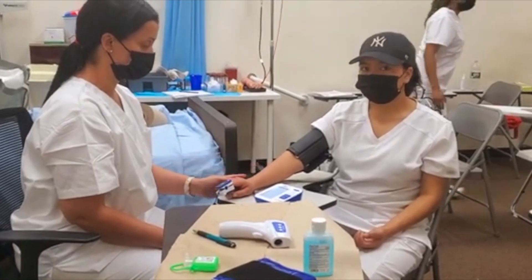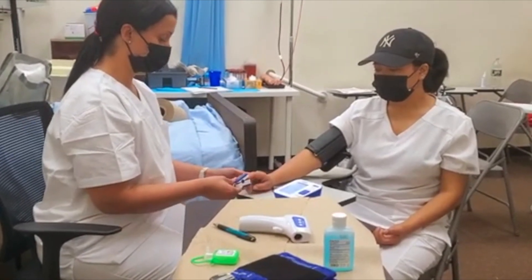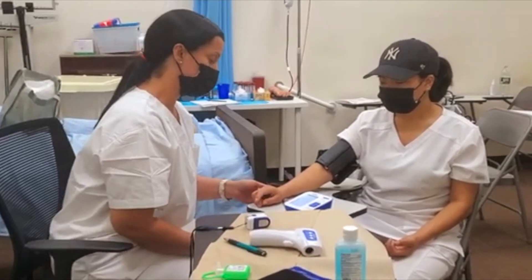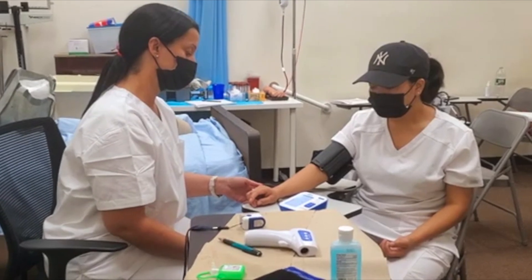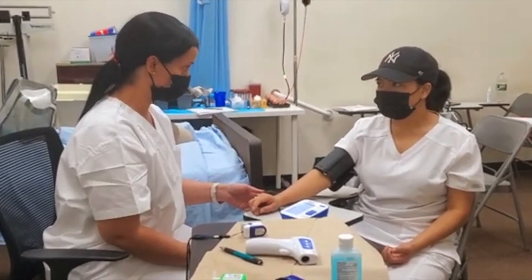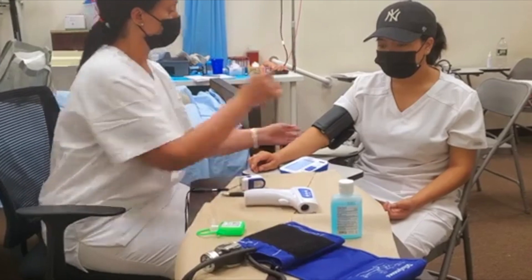We create these videos to help students and to increase their clinical skills. So your pulse oximeter oxygen reading is 89, and your blood pressure — the systolic is 105 over 62 diastolic — which is normal, because normal blood pressure should be under 120 over 80.